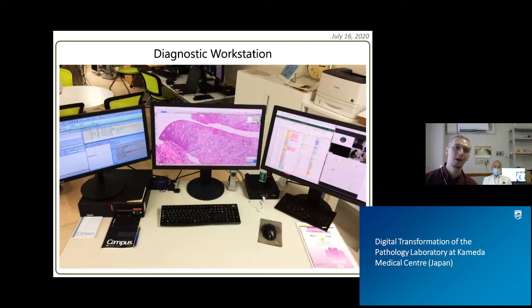I know that this question may have another sub-question about validation. For example, there are guidelines issued by the Royal College of Pathologists and the University of Leeds team saying you need to spend 2 months sitting and matching glass slides with the virtual slides. In my opinion, that is too much. I agree that we need some validation, which is just like 60 cases by the College of American Pathologists guidelines. But you become familiar very quickly.